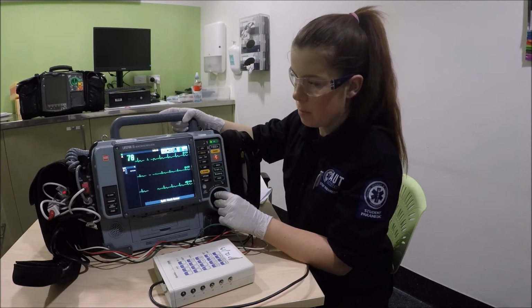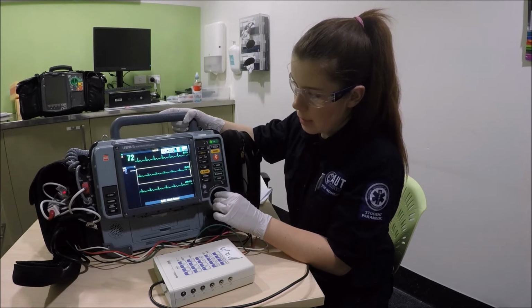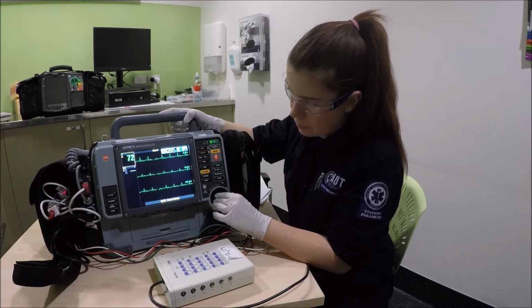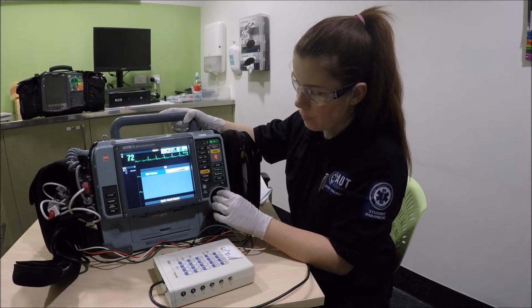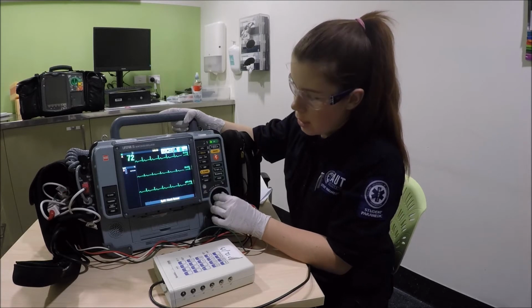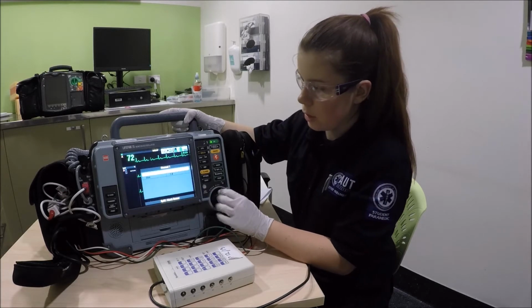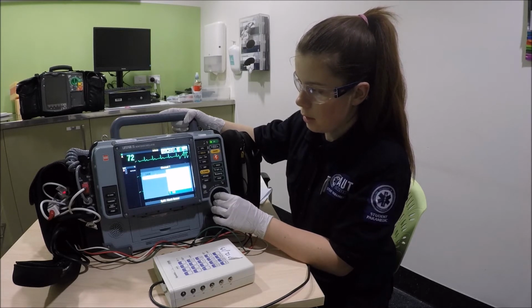It's normal sinus rhythm. If we want to change the QRS volume, we can just do that by selecting here, say the heart rate, putting QRS volume and turning it up. If we want to change the ECG size, we can just select that line, go down to size, and increase it.